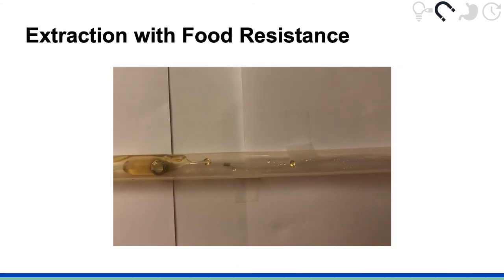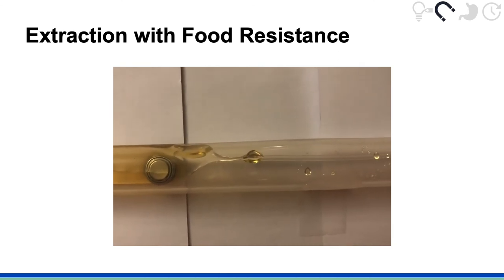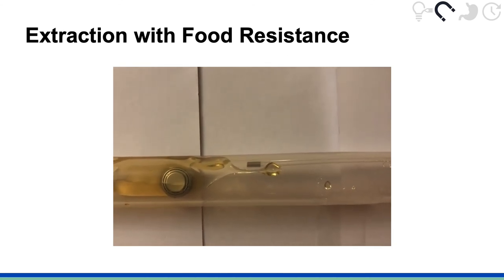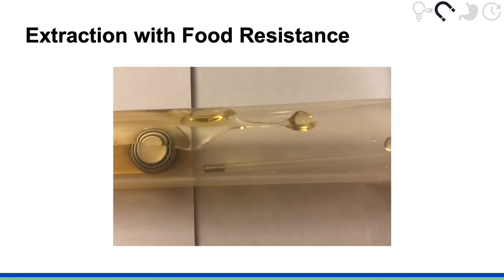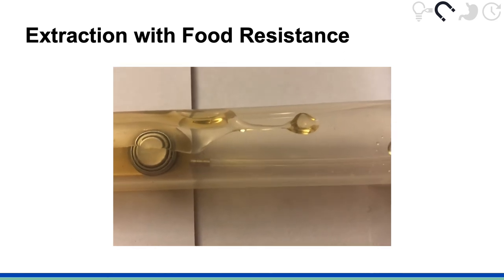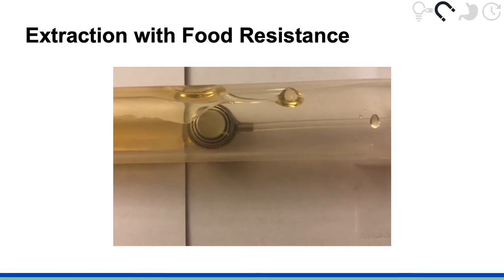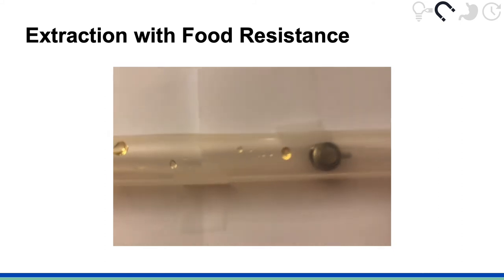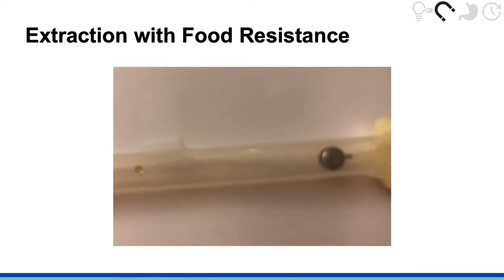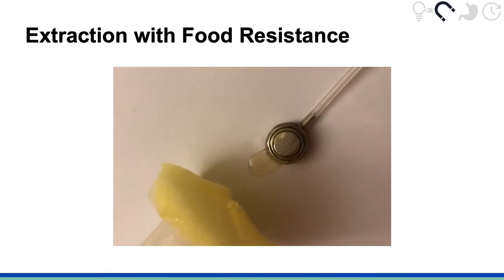We tested the Endomagno with commonly swallowed objects in different conditions that could be found in vivo in the upper GI tract. In this video, a button battery is submerged in honey, which is a viscous liquid. Even with food resistance, the Endomagno holds onto the object, extracts it through the sphincter, which expands and deforms due to the large, bulky size of the button battery, and successfully removes the object.